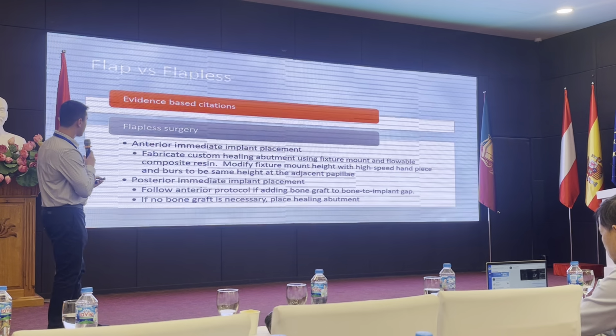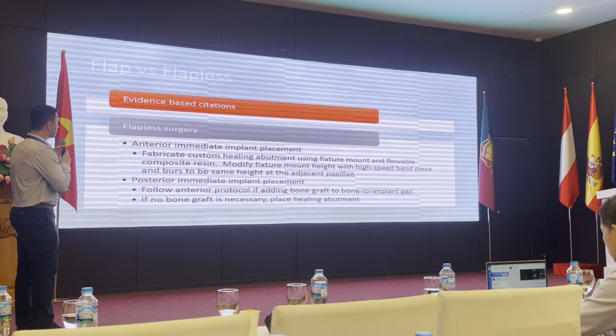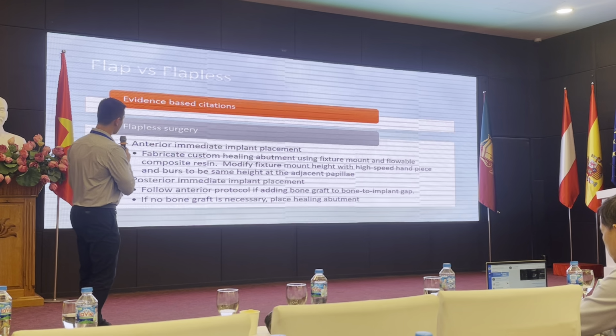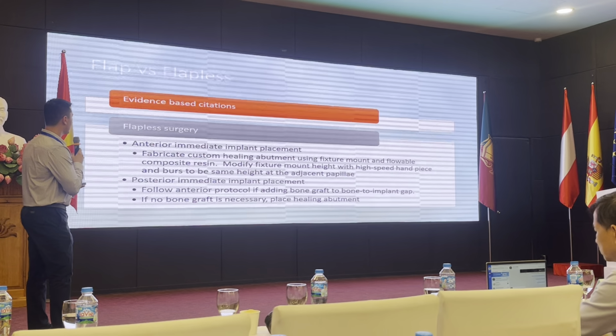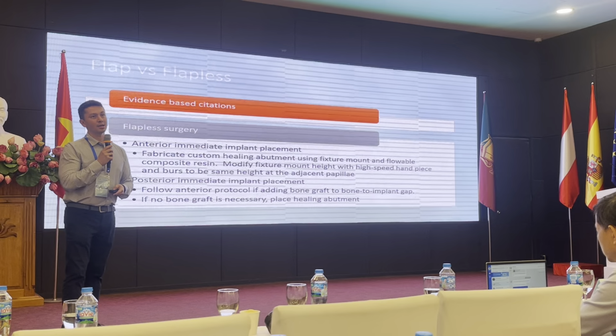So we go through these kind of fast. There are some advantages to doing a guided surgery. Oftentimes we're able to do what's called a flapless surgery. And I didn't put the citations here, but there is good evidence-based research that supports when a flapless surgery is indicated and when it's not indicated.